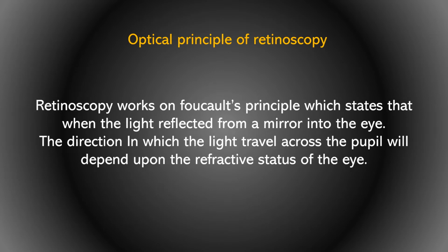Optical principle of retinoscopy. Retinoscopy works on Foucault's principle, which states that when light is reflected from a mirror into the eye, the direction in which light travels across the pupil will depend upon the refractive status of the eye.